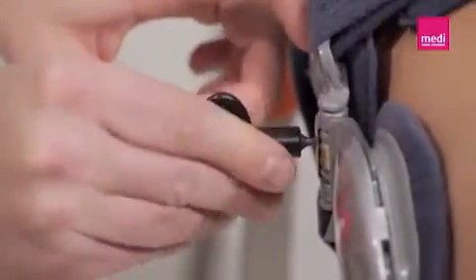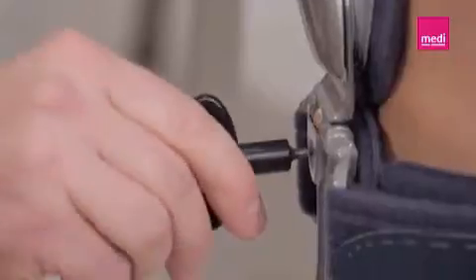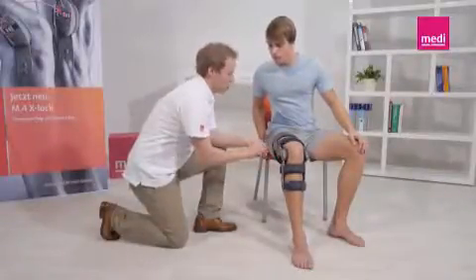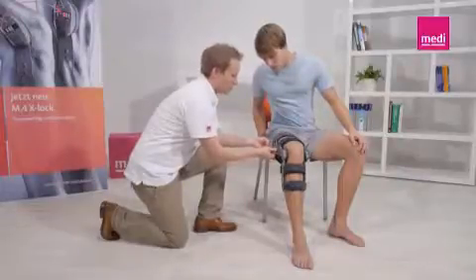The hinges above and below the knee joint can be set to reduce varus for bow leg deformities and reduce valgus in knock knee deformities, depending on the product variant. In this case, it's advisable to show the patient how to set this himself, in order to be able to adjust the orthosis to the treatment status at any time.